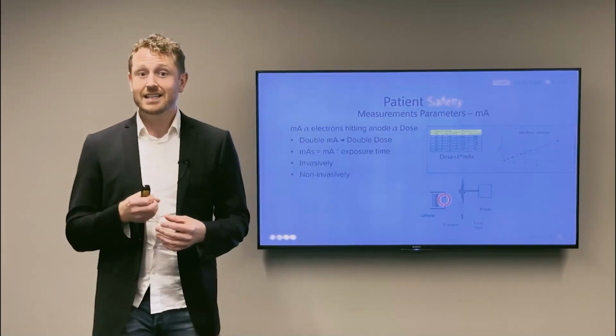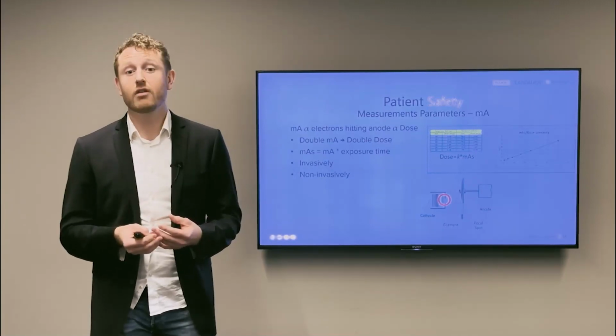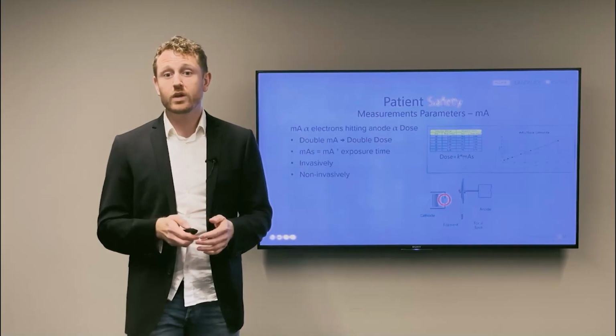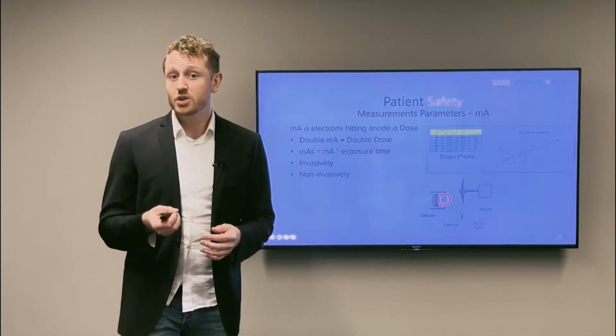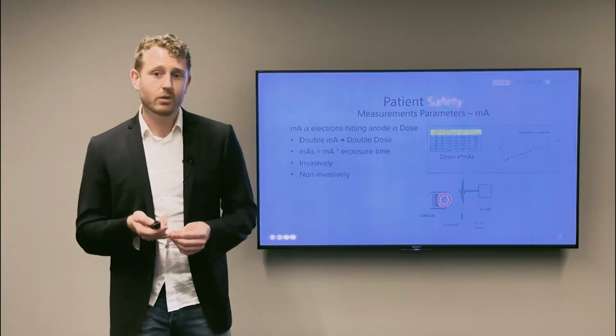If mAs is changing over time, it will change the quality of the X-ray image taken. Most likely there is something wrong with the internal circuits in the X-ray machine. Thinning of the filament will change mAs, but it is usually controlled by the X-ray machine itself. Another fault can be a flaw in the power grid.